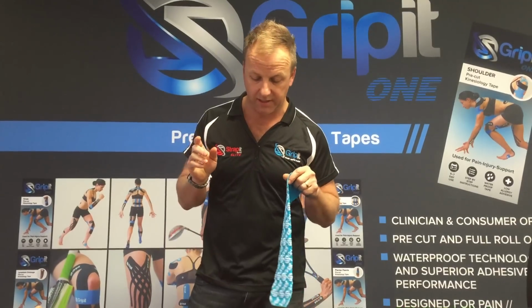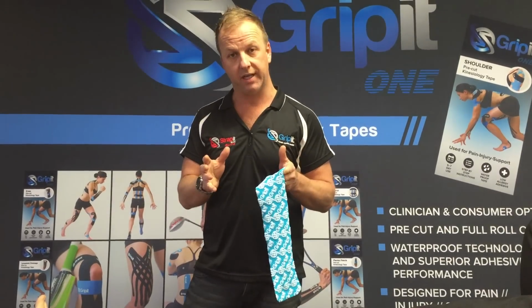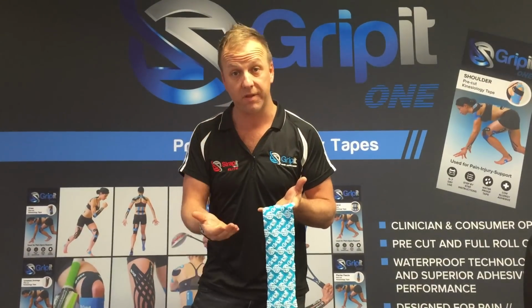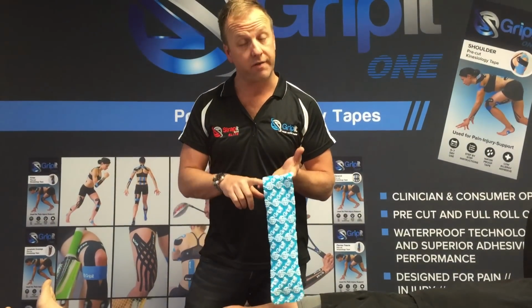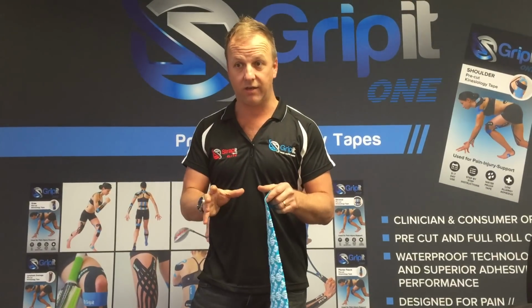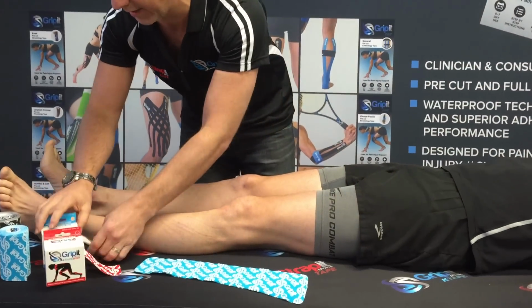All right, let's get to the knee technique. Now, with the deloading of the knee technique, the essence of the technique is effectively to deload the knee. So it's not pathology specific. If you're trying to deload the knee, you might be trying to unload a patellar tendinopathy, some form of quadriceps tendinopathy, even arthritis of the joint, so just wear and tear, or a meniscal tear that's grumbly. So it's important that we just focus on the deloading technique to try and offload a structure that is either injured or compromised. Okay, so let's get to that technique today.